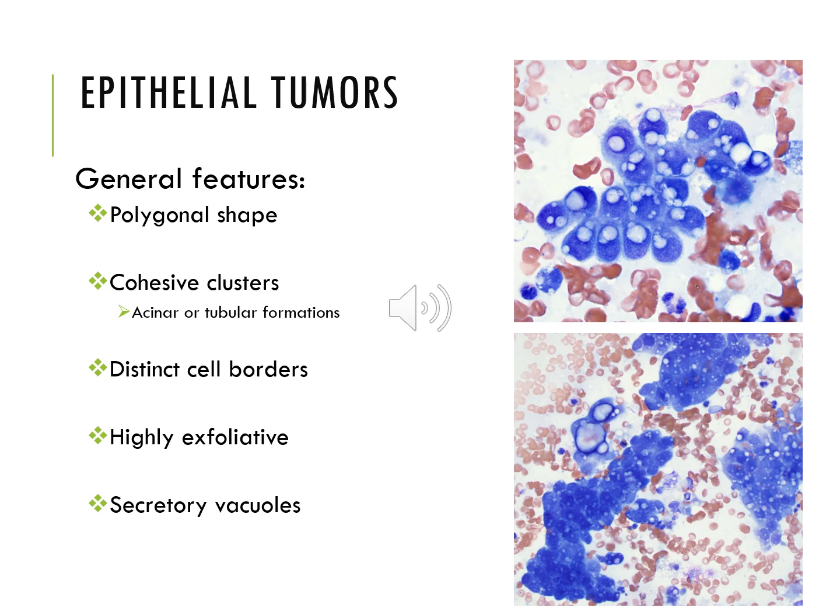So in the bottom image here, we have this kind of aggregate of epithelial cells that's forming what we call a papillary structure. That's very common to see papillary structures in tubular formations. And then the acinar formation that I showed you previously, which is a more circular structure that the cells are forming. Those are very commonly seen with epithelial neoplasias.